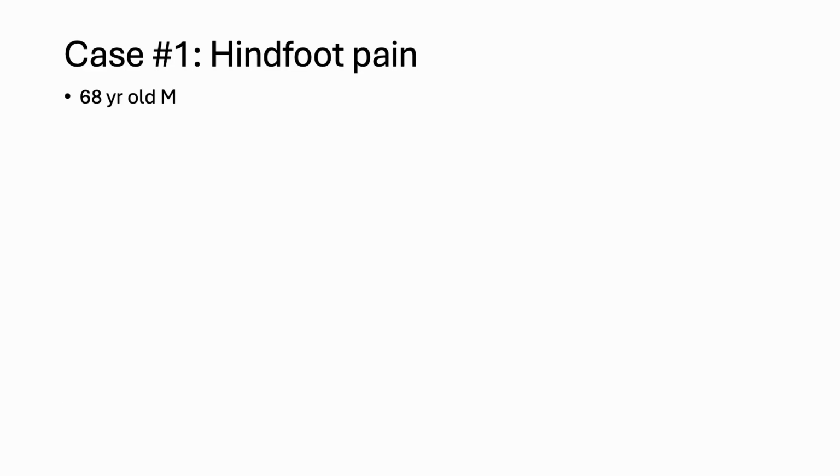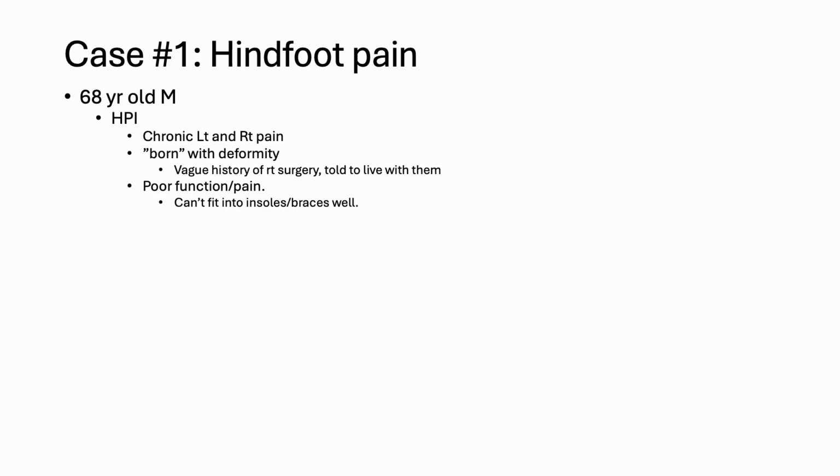I got a case, a hindfoot pain guy, a 68-year-old male at the time that he came in. He's had chronic deformities of both right and left feet. His right foot had surgery on it a long time ago, born with it. A vague history of surgery, like I talked about, when he was young. He's had poor function, poor pain. He can't fit into shoes or insoles. He's just really struggled. Bracing really hurts him when he puts it in. Large deformity. Otherwise, he's healthy.